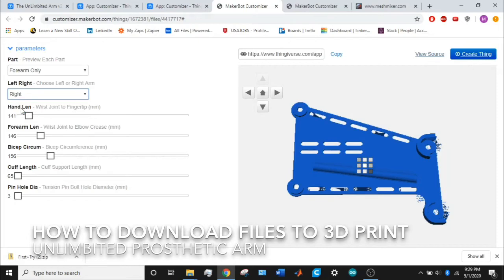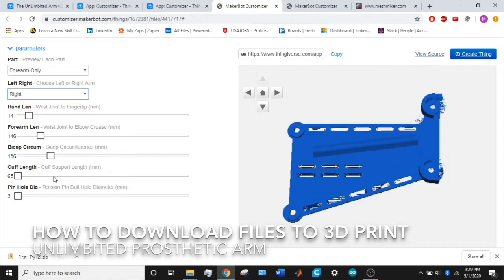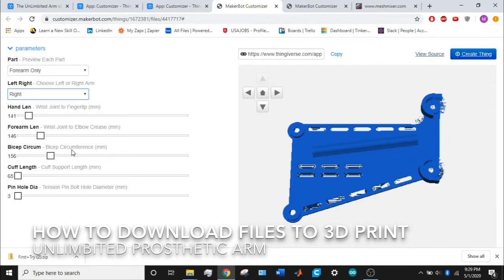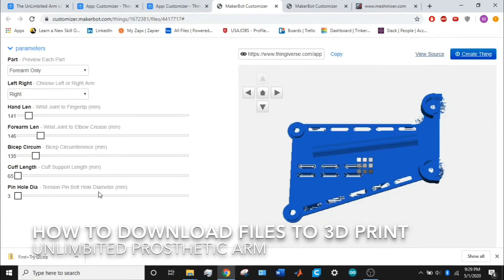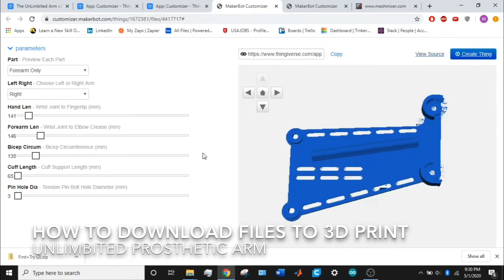Down here are measurements you need to input, but you actually only need two measurements: from the wrist joint to the elbow and bicep circumference. Bicep circumference is pretty obvious—you just need the circumference of the person's bicep in millimeters. You input the size, and if I change the size here, you'll see this part change.